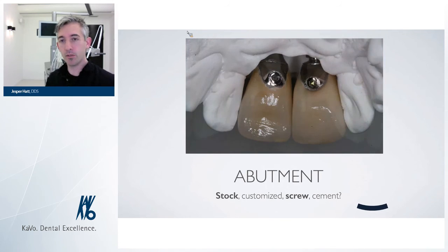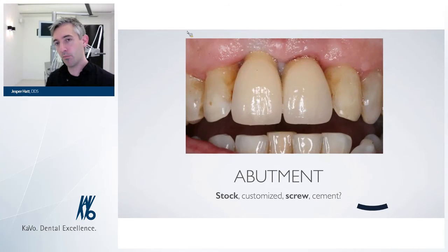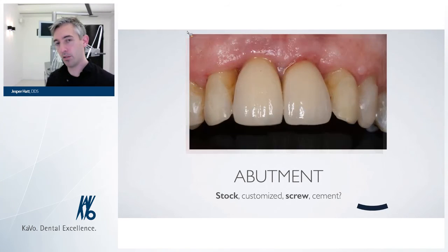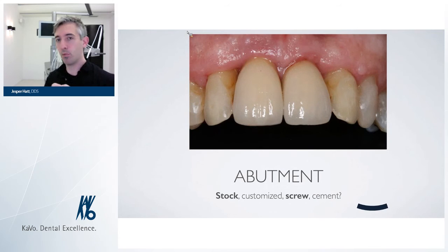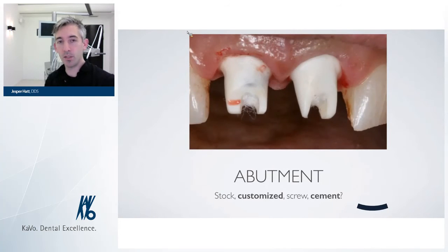And I wonder, here it doesn't look that inflamed, but it starts to look inflamed here. Could that be because there's some kind of margin that isn't sealed off? I don't know, but I can't let the thought go. So I thought we had to come up with another thing. And then we started to look at the possibility of using these zirconia buttons.